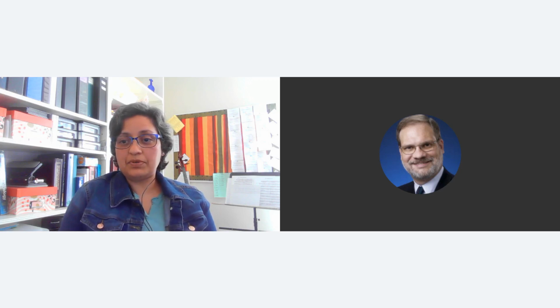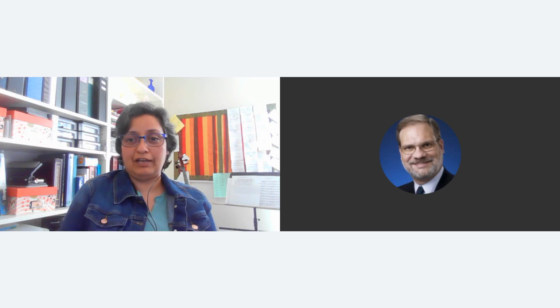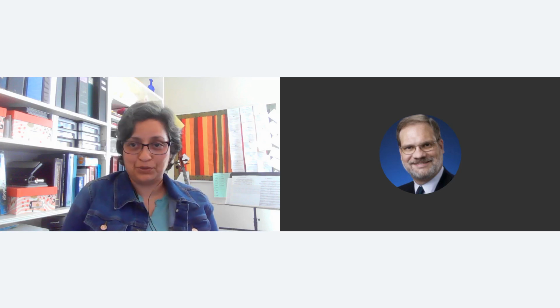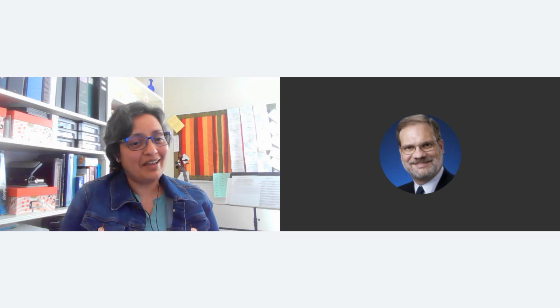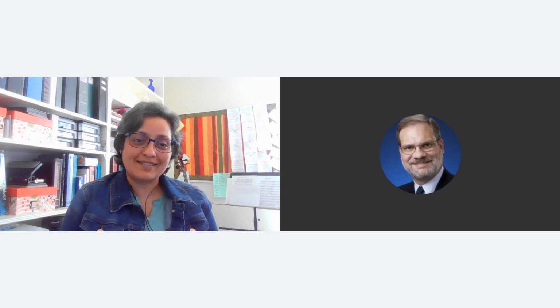All right, 70% of you said these are left LPDs with mild spread to the right. So this is the way we used to describe the EEGs before the ACNS terminology came out. That's how we were describing. So it is not wrong. And bilateral asymmetric LPDs, that's what is described in the ACNS guidelines in the terms.